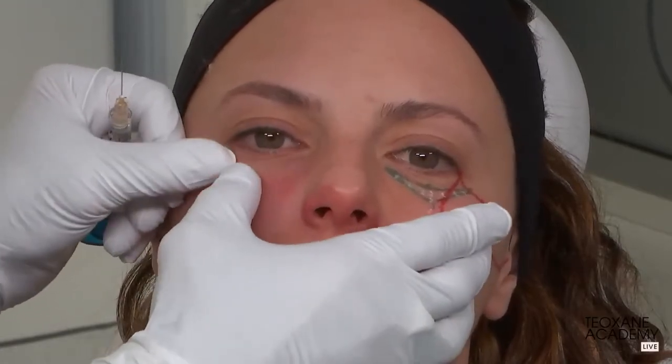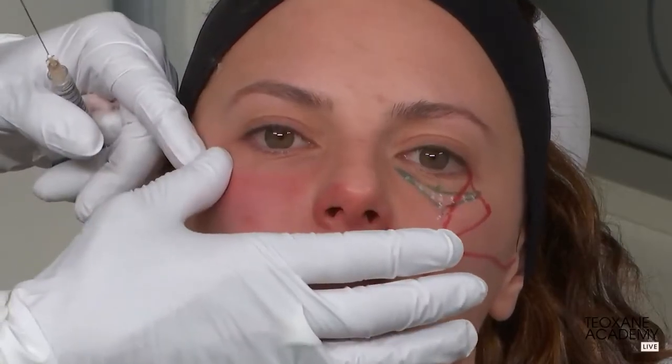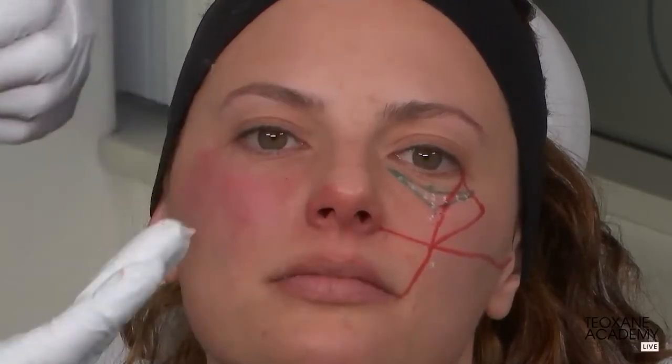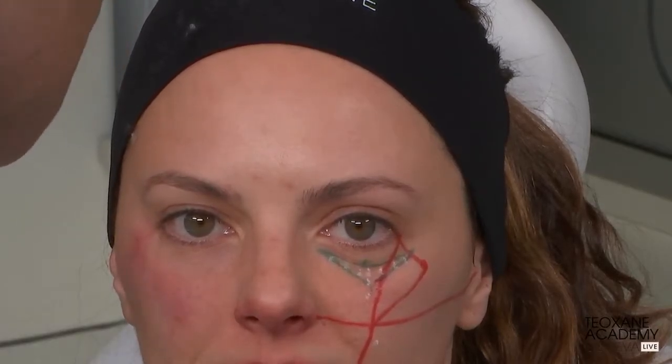And it's probably the time when I check the patient, because my algorithm consists in injecting, in my practice, actually, I need to prepare the patient for what's going to be the cost of the treatment. So it's usually 2 syringes for a treatment as such. Which amount of Redensity 2? We have half of a syringe left. So we have used half of a syringe for the first part, and then we have used the second half of Redensity 2. So if you could zoom out a bit, I ask the camera right there.